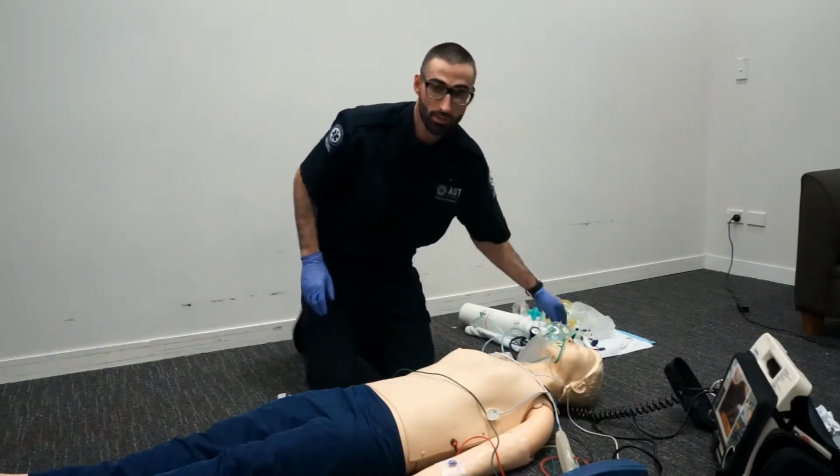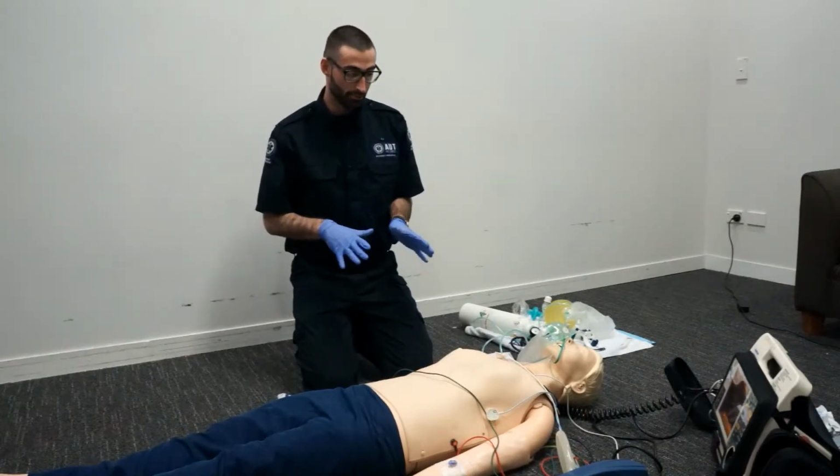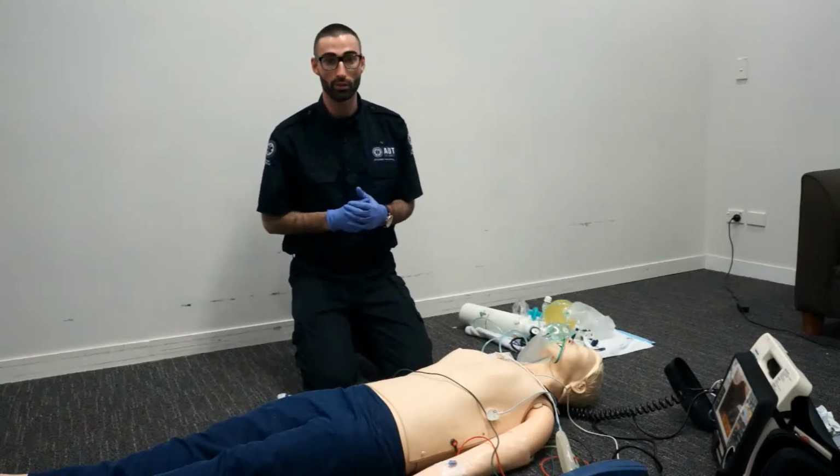There are 2 forms of cardioversion. These are electrical and chemical. As Steve is severely compromised due to severe hypotension, he's unable to obey commands, and he appears status 1, we will go with the electrical route.